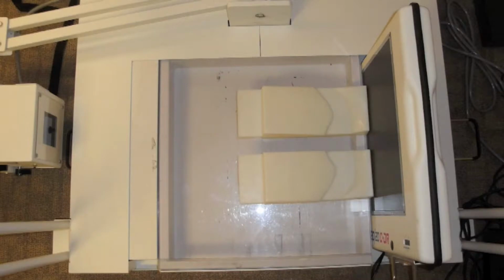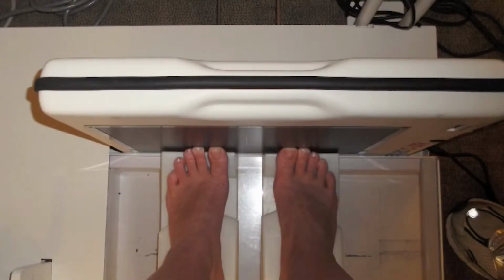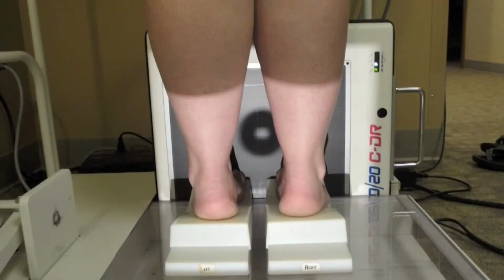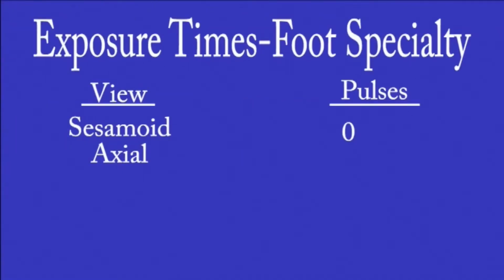You will place the L and R side by side and take them both on the same cassette. Have the patient stand on the platforms with their toes up to the cassette and pull the X-ray down just like a lateral. You may need to adjust the neck of the head so that it is lit up fully. Make sure the black dot from the light is situated between their feet, the light covering the whole cassette. The pulses will need to be adjusted because this is a denser shot, so you will adjust them to 0, 1, 0 and take the view.